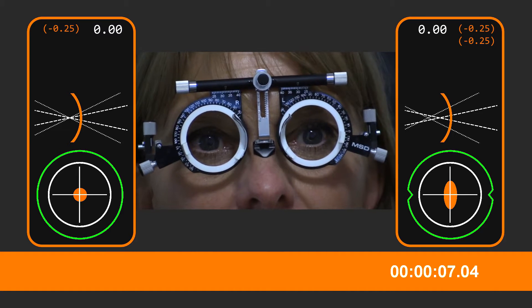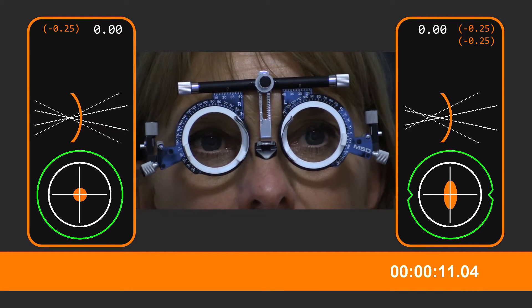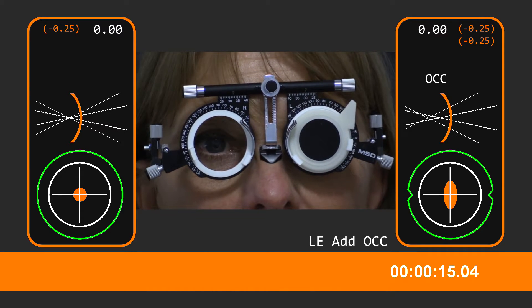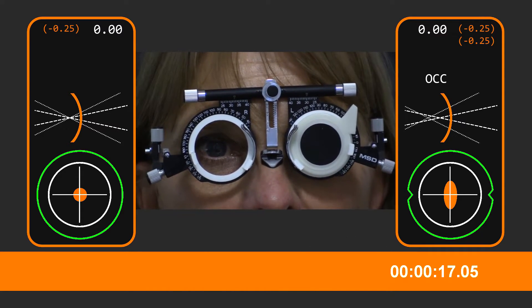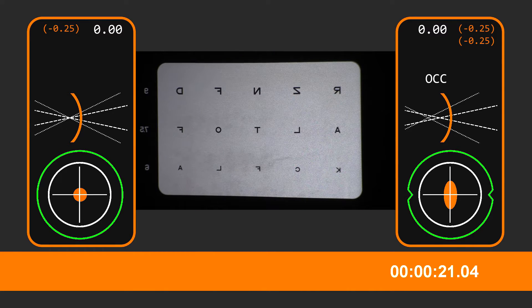So let's just quickly see if I find the blank. I lost it last time. There you go. So can you see any of those letters there now? I can indeed, yes. Read them for me. D, F, N, Z, R.